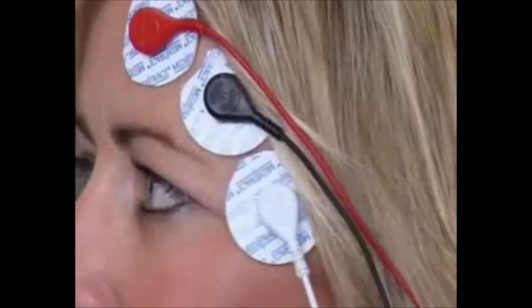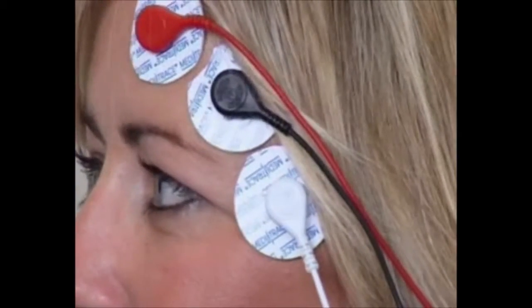No. Okay, good. So we've got the biofeedback EMG, we've got some sensors over one of the main clenching muscles. This muscle is called the temporalis muscle, and we're going to look at the readout on a computer screen of the degree, the intensity of clenching without the splint, and then with a full mouth splint, and then with the MCI splint. Okay, let's start with the demonstration, and let's measure the degree of clenching that you can do with this temporalis muscle. Adjust it there, that's great.